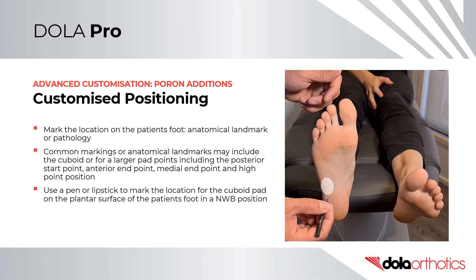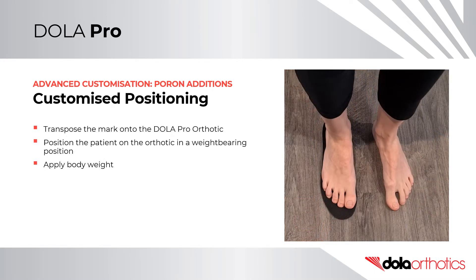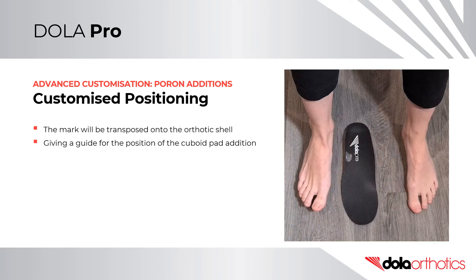Use a pen or lipstick to mark the landmarks on the plantar surface of the patient's foot in a non-weight bearing position. To transpose the marks onto the DollarPro orthotic, position the patient on the orthotic in a weight bearing position and apply body weight. The mark will now be transposed onto the orthotic shell, giving a guide for the position of your cuboid pad.